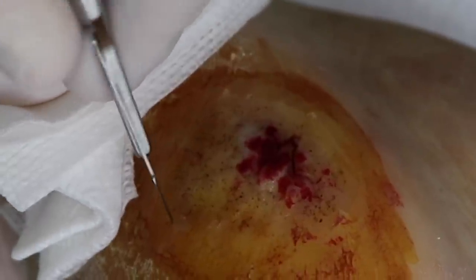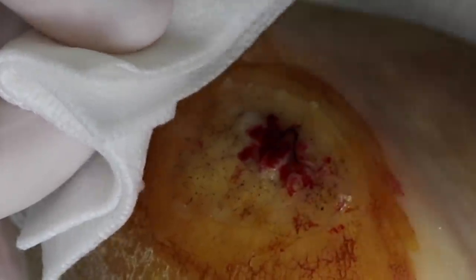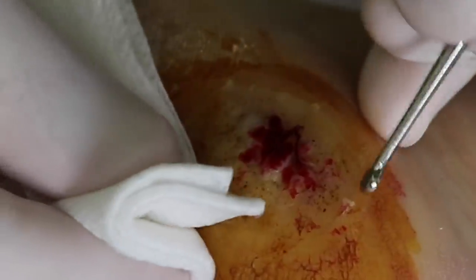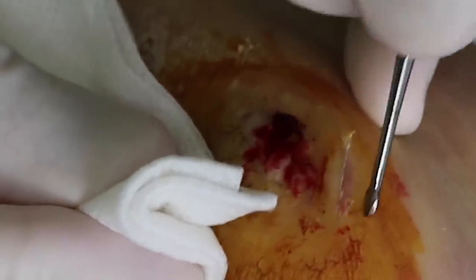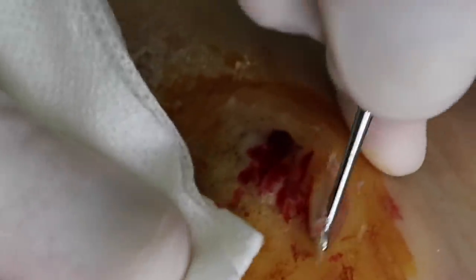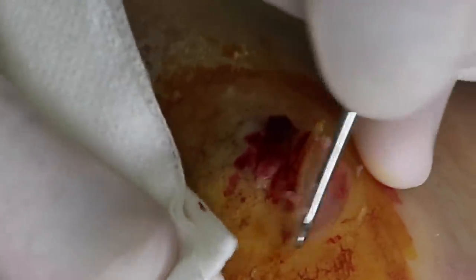When did you figure you needed more help with this? When I'd been doing treatment for a year and it'd gotten worse — I was like, there must be a better way. So we're just going to lift that wart right off, and it's literally coming right off. The reason it looks so much worse was the area of pressure. There's a lot of pressure here so the body was just covering it up, trying to protect itself.